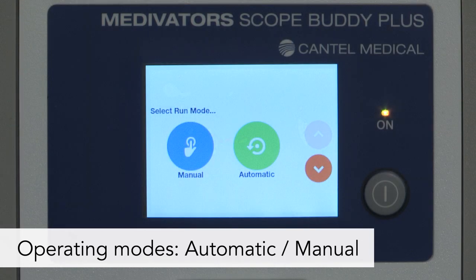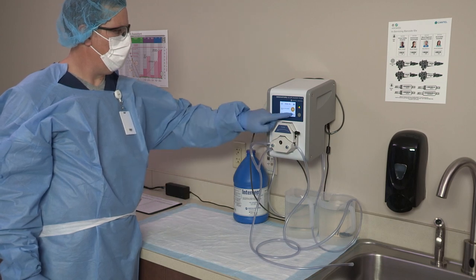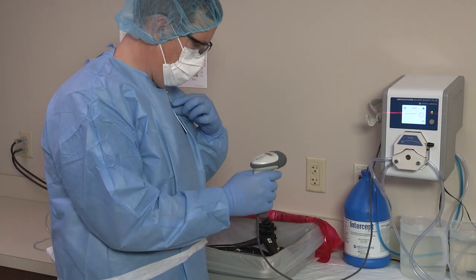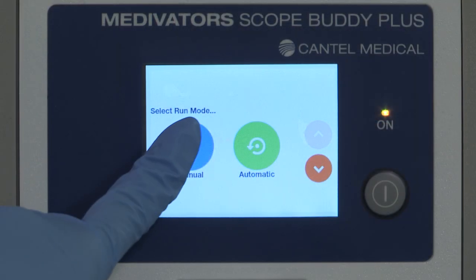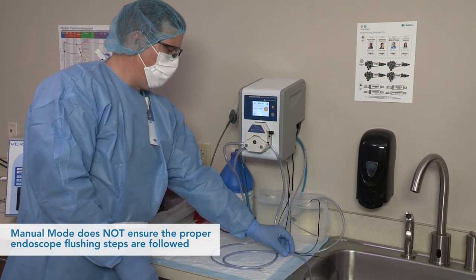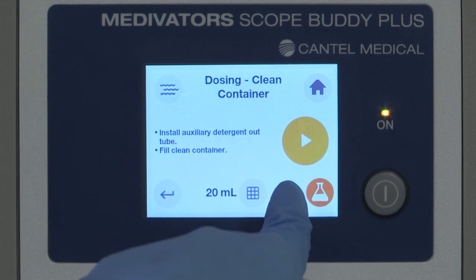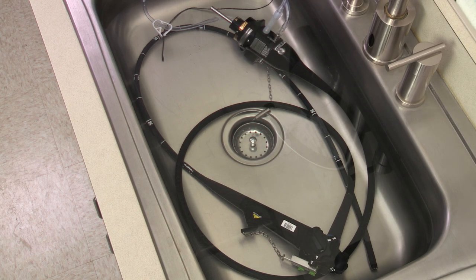There are two operating modes: automatic and manual. Within these modes are two different pathways to pull fluids — from clean containers or from the sink. The Scope Buddy Plus Flushing Aid can be customized to provide the best configuration for your department. Automatic mode prompts the user for each step of the manual cleaning process; steps must be completed in order and are logged for full cycle documentation. In manual mode, the user selects each step of the manual cleaning process, which does not ensure the proper flushing steps are followed, and logging of cycle data will be limited.